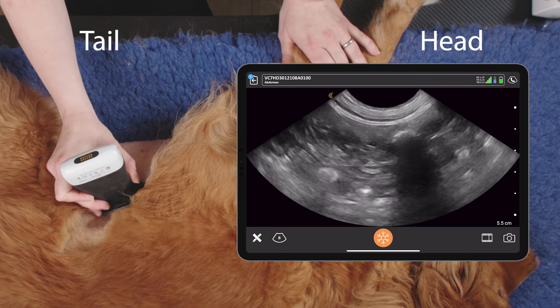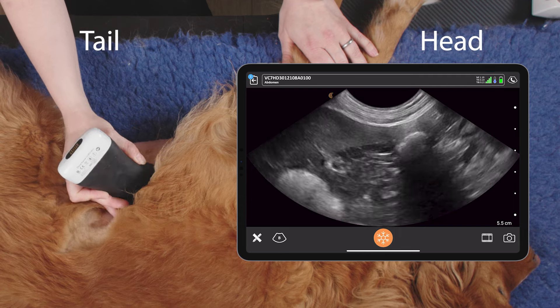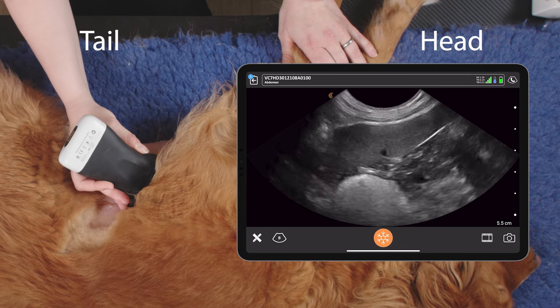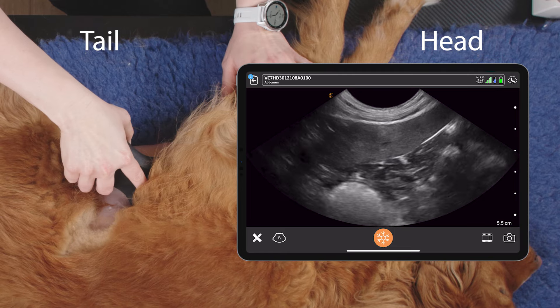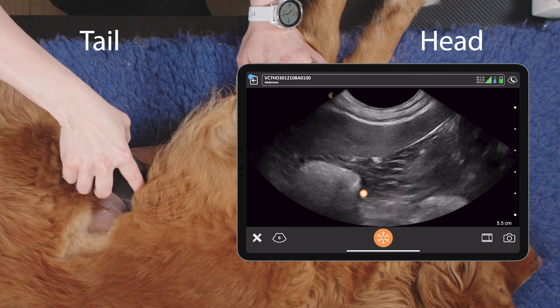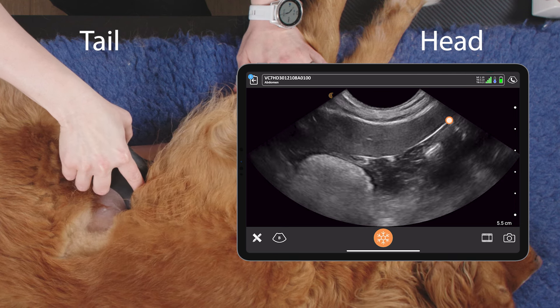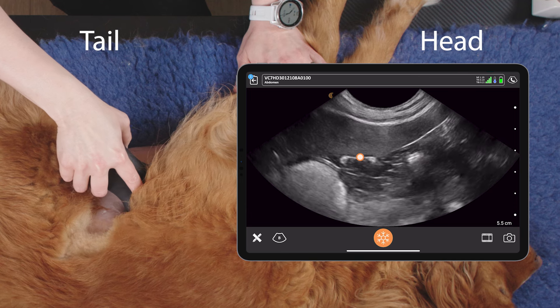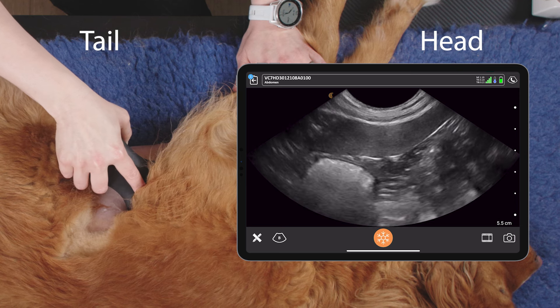We want to follow this structure cranially until we get to the view we've got here, where we have the stomach cranially in our image, the spleen in the near field, and the transverse colon caudal. In this region, if we fan, we may be lucky enough to spot the left limb of the pancreas.